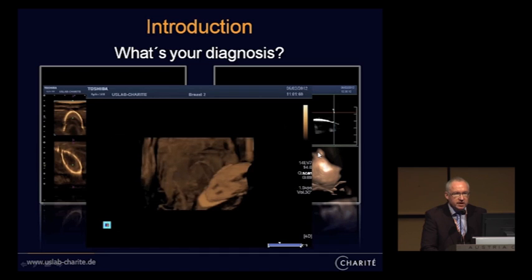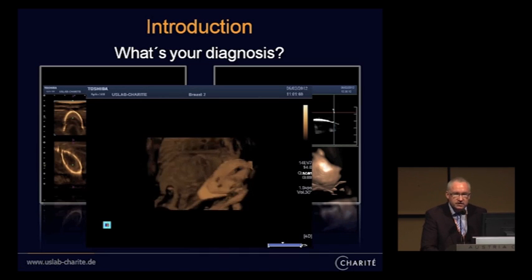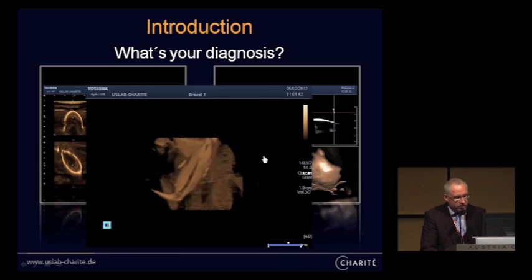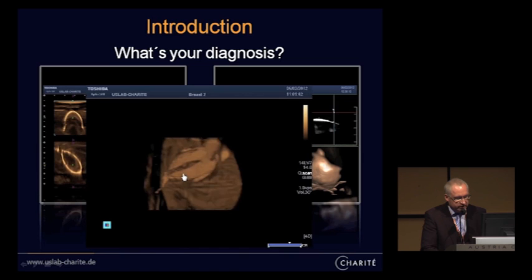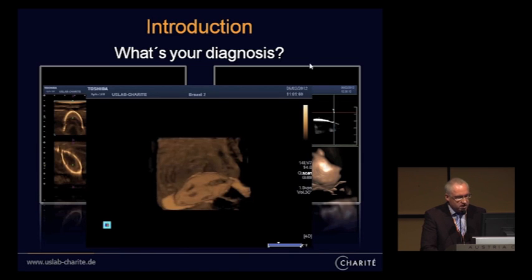This is the fishing experience, and at the end of the story, I will show you this in definitely real time. Oh, where's the fish? It's missing. Not really. Here's the fish, very nicely visible with this 4D fast technology. So we move on to abdominal and vascular imaging.